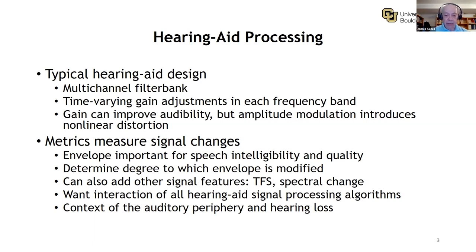in measuring. We also want to develop a metric that can measure everything that is going on within the hearing aid. That is, we don't want something that is so thoroughly tied, say, to noise suppression that it cannot measure other aspects of hearing aid processing, such as frequency shifting.